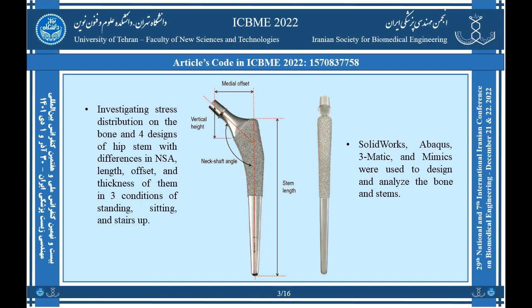So, depending on the studies that have been considered in the past, it's clear that the design of the stem is very important and effective for improving the quality of joint replacement, the quality of the surgery, and finally the patient satisfaction.